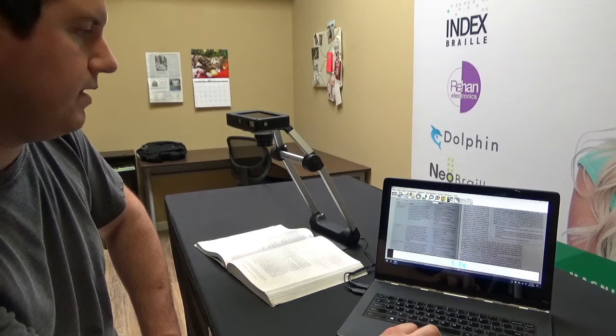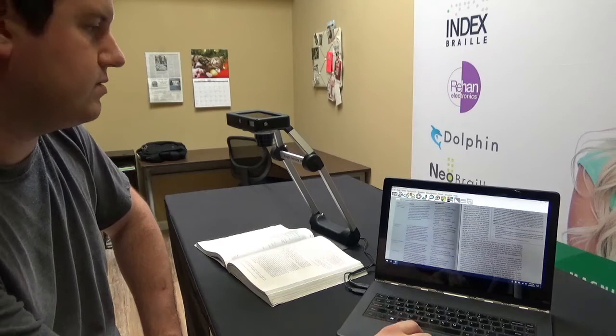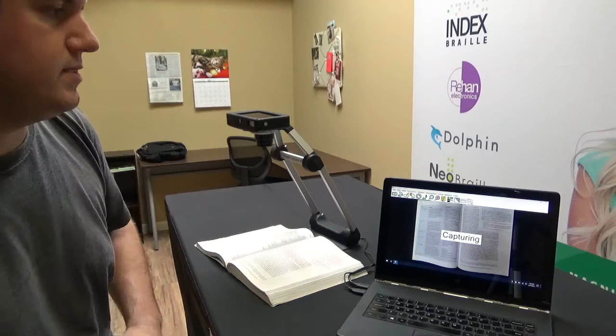I'm going to point it at my textbook here. There we go. I'm going to zoom out just a hair. That looks pretty good. All right. So I'm going to go ahead and capture this. Same thing. Click on the camera icon or you could press the enter key on your keyboard.